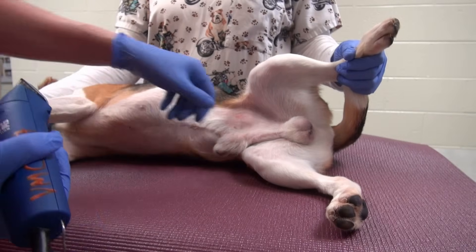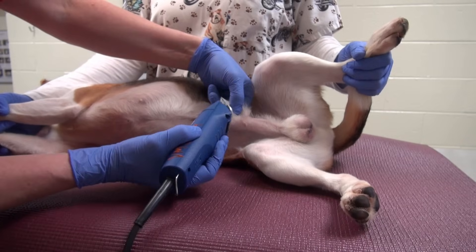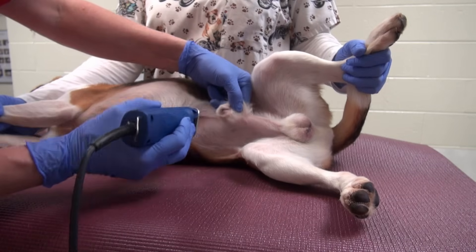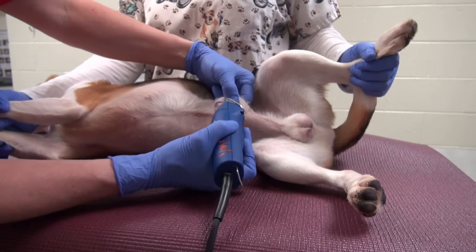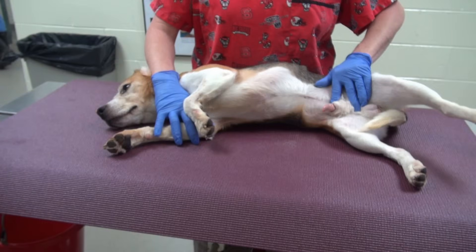If your dog has long hairs at the tip of his sheath, use the clippers to remove them. Take care to not scratch the dog's skin. Dogs should be restrained in lateral recumbency for the procedure. If your dog is sedated, or just cooperative, one person can usually restrain the dog and exteriorize the penis.